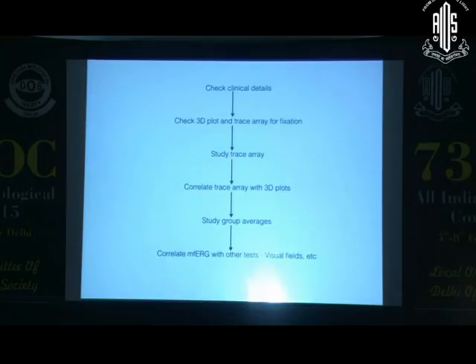And this is just to summarize everything. You check the clinical details of the patient. Once you have the multifocal, if you have a printout with you, go through the clinical history, why the test was ordered, and how you think the multifocal ERG is going to help you. Look at the 3D plot, look at the trace arrays, study the trace arrays, and correlate with the 3D plot. Everything going ahead, you know the recording is okay. If required, do group averages, and always try to correlate it with the other clinical findings, especially the visual field findings, which give you a lot more information.